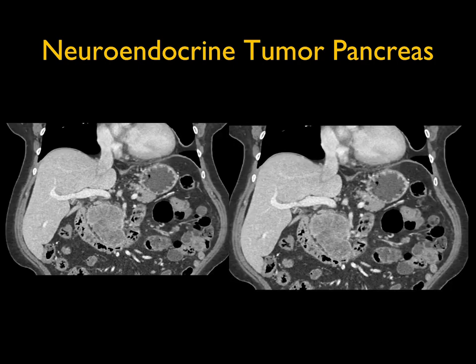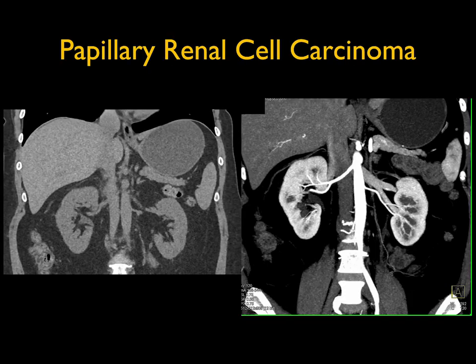There's some splaying of the vessels, very nicely shown on the coronal view. This was a difficult neuroendocrine tumor because it's so cystic — you might wonder if it could be a serous cystadenoma or an MCN. But remember that although neuroendocrine tumors are often thought of as very vascular, they're not always.